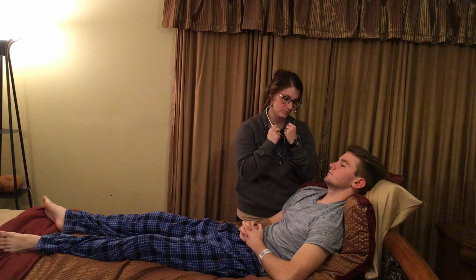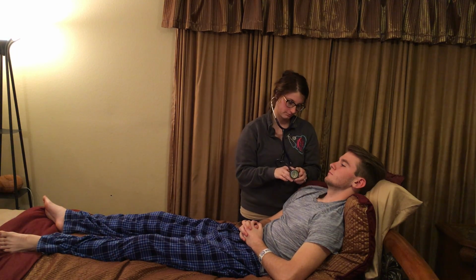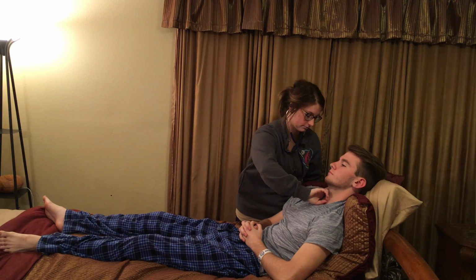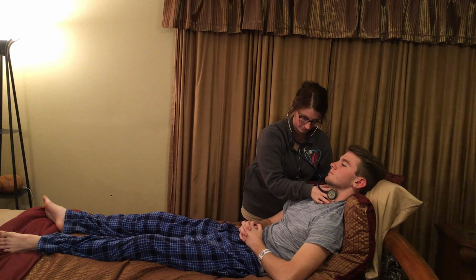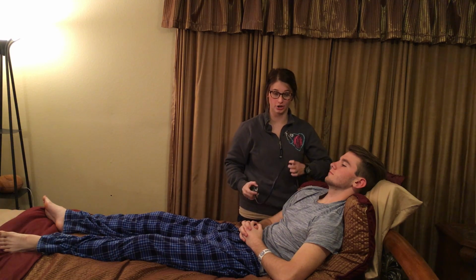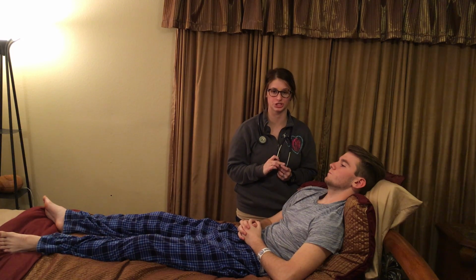I'm going to ask you to take a deep breath in, out, and hold it for me. And again. Good. Only the pulses should be heard. There should be no abnormal sounds such as blowing or swishing.